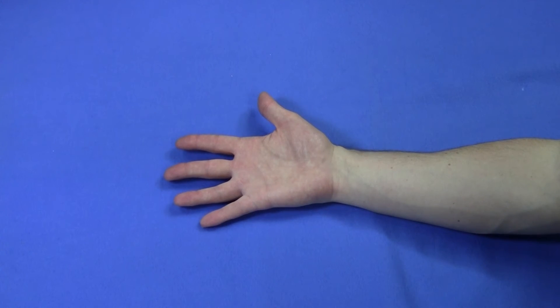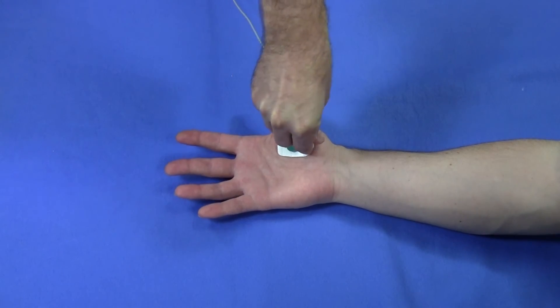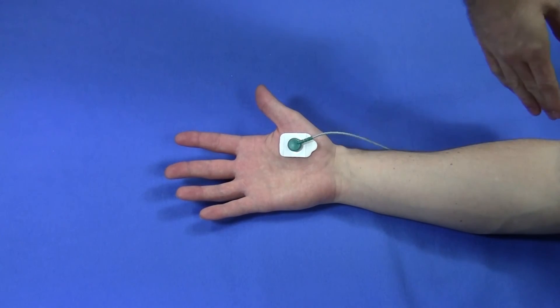I'm going to ask my subject to hold out their hand. If the subject is required to perform a task with their hands, you should record EDA on the non-dominant hand or the hand which will be used the least. I'm going to take an electrode from the strip with a green lead wire on it and place it on the meaty part of the palm, with the lead wire running back towards the subject's elbow.